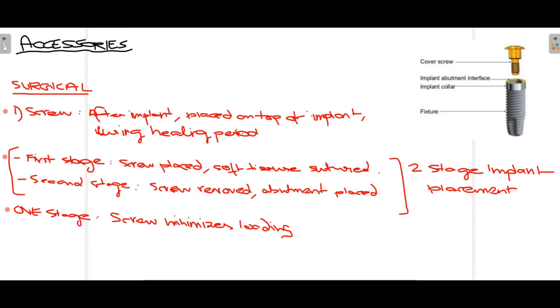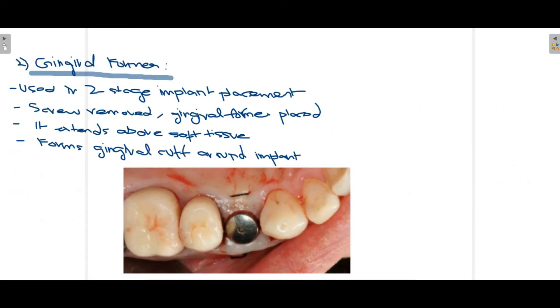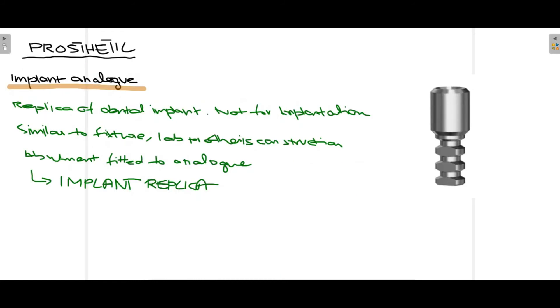The second surgical accessory is the gingival former, used only in the two-stage implant procedure. When the cover screw is removed, the gingival former is placed. As you can see in this clinical picture, it extends above the soft tissue. The function of the gingival former is so that a gingival cuff can form around the dental implant — essentially contouring the gingiva.